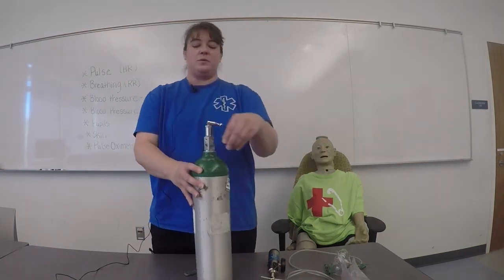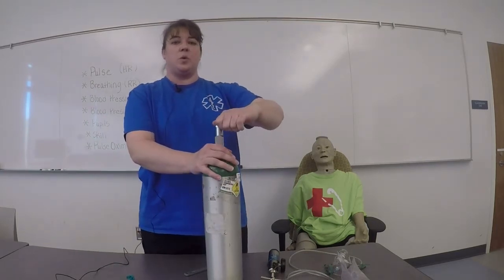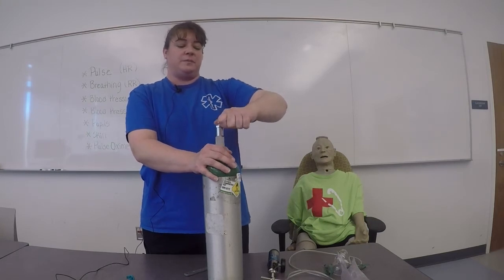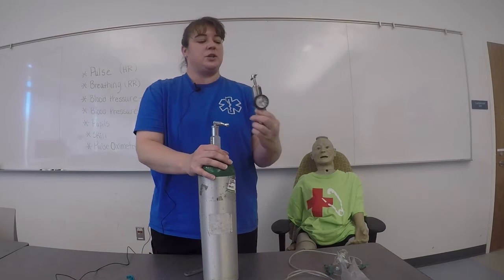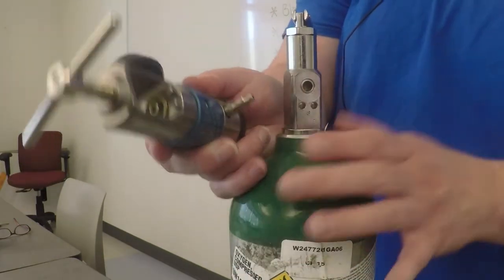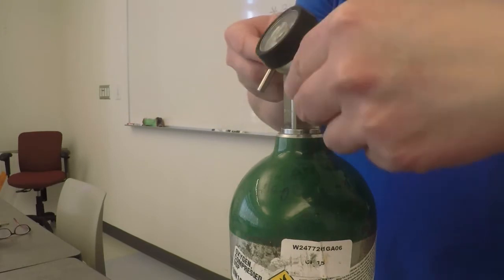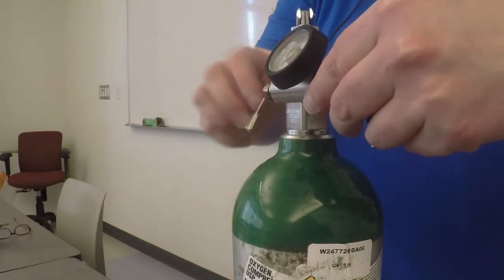I'll take my tank and remove the seal. I'll then turn the tank one quarter turn to blow off any dust and debris from when it was filled. I'll pick up the regulator and make sure that the regulator washer is in place, then line up the pins on the regulator to the pins on the oxygen tank, and tighten the T-screw — hand tighten only.